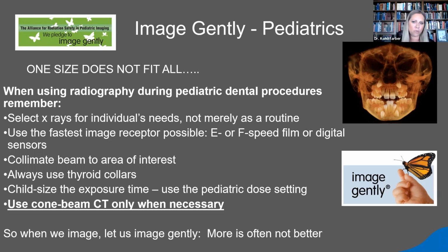Now, we don't want to be afraid to use a CBCT if it's necessary. And definitely there are times when it's necessary, even with a child. So don't be afraid of that. This is a fantastic tool in your toolbox, but we want to use it responsibly, just like anything else. So basically this says when we image, let us image gently, and more is often not better.